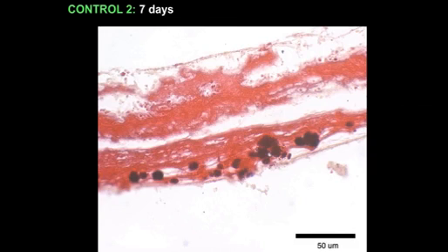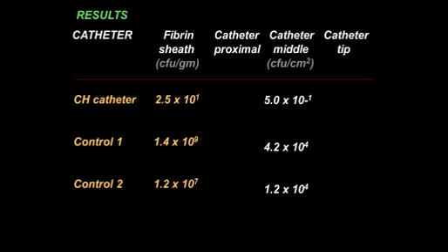Looking much closer, this is the intraluminal edge of the vein wall and the extensive biofilm formation. So those are some of the first photos of biofilm formation within thrombus as well as vein walls as well as fibrin sheath formation, and they give us a lot of knowledge now about the relationship between infection and thrombosis. How did that turn out from a microscopic evaluation and biofilm formation?